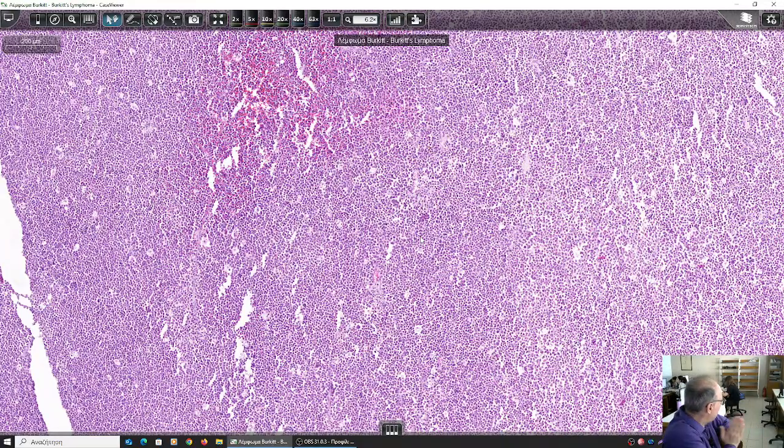This is of B cell origin, so we expect that CD19, CD20 is expressed. This lymphoma derives from the germinal center, despite being high grade, because with such high proliferation index, it's a high grade lymphoma, not a low grade, as we saw the case was in the follicular lymphoma, non-Hodgkin.